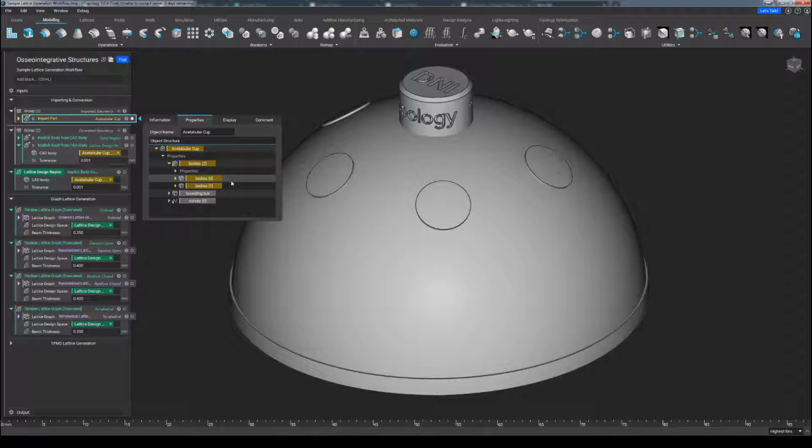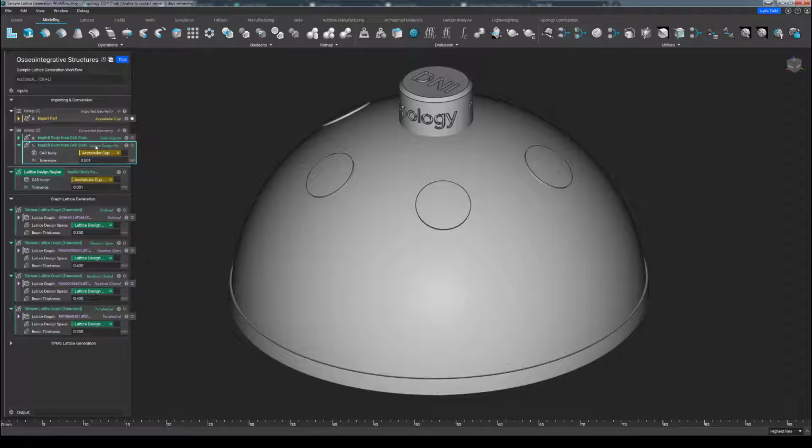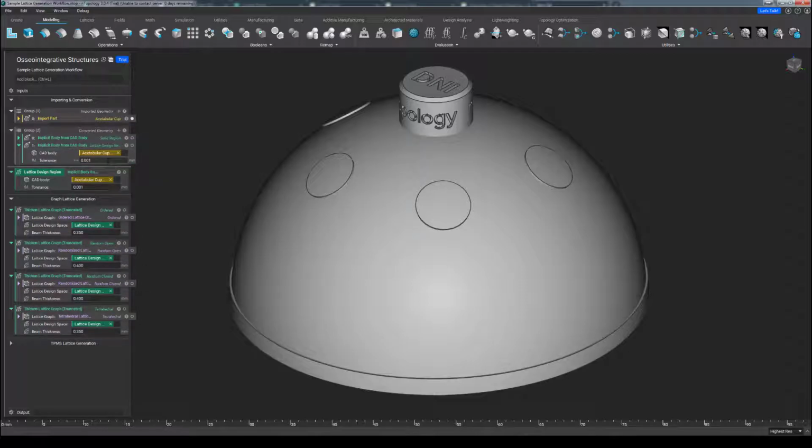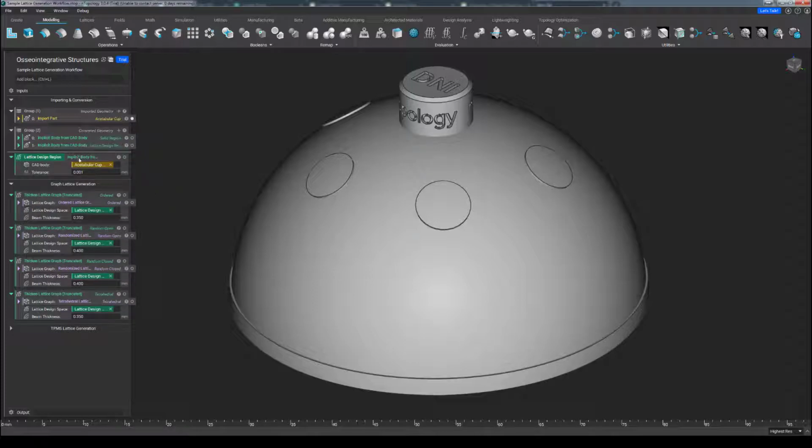From there, we are simply converting them from CAD model to nTopology's implicit model using the implicit body from CAD body block, while also ensuring that the tolerance value for these blocks is set to 0.001 millimeters, up from the default of 0.01. Now, I've chosen to drop the now implicit lattice design region into a variable, simply because I plan on using this more than once. As a reminder, you can use variables however you like, but as a rule of thumb, I only tend to create variables when I intend to use something more than once.